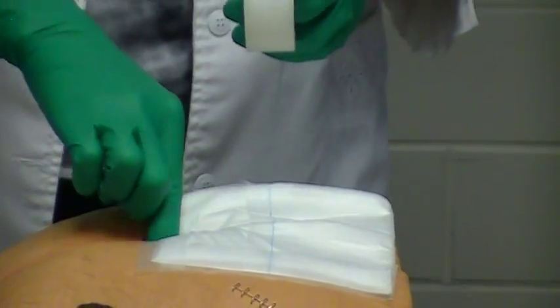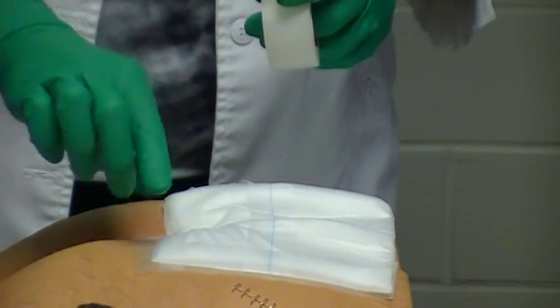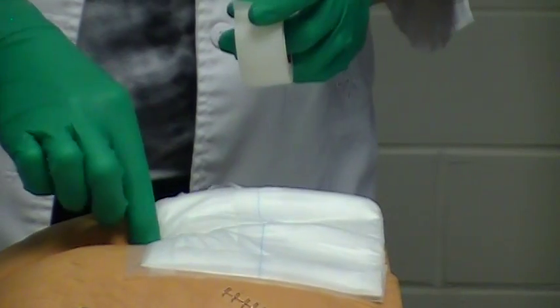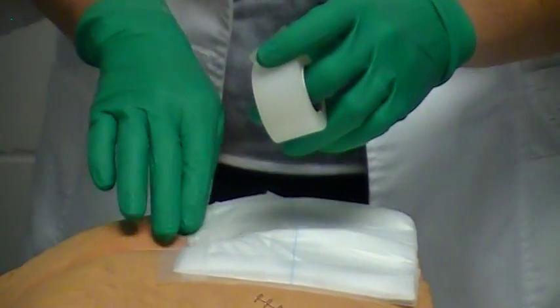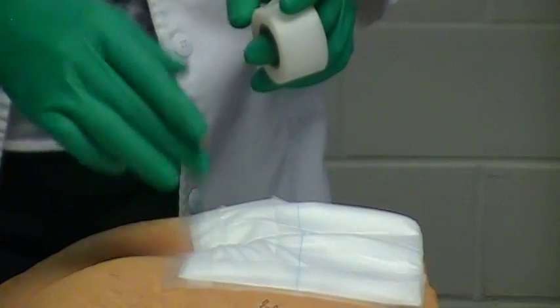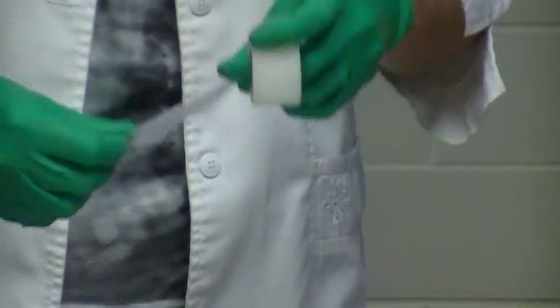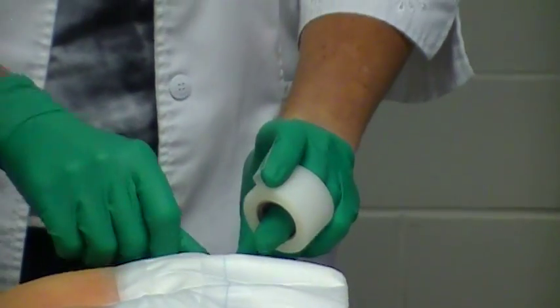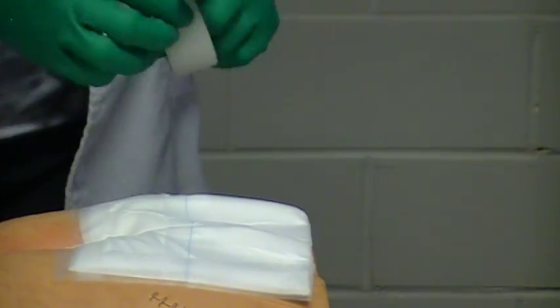For wounds that are on the coccyx, make sure that you get a really good seal at the top of the buttocks, right below the coccyx area. That way, if you have someone who's incontinent, there will not be any urine or bowel movement to come up through that tape. Also, that area tends to have more moisture, just perspiration, so it's easier for the tape to loosen up right there. So make sure you get a good seal in that area.